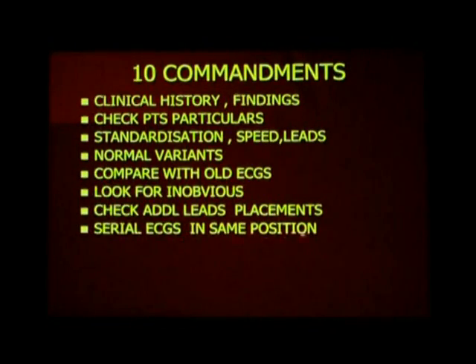Serial ECGs in the same position. Serial ECGs are not taken just for admission to the hospital. Somebody has to see the serial ECGs, and that somebody should know something about the ECG to interpret it, and he should always compare with the previous ECG. For that, the ECG should have been taken in the same position.